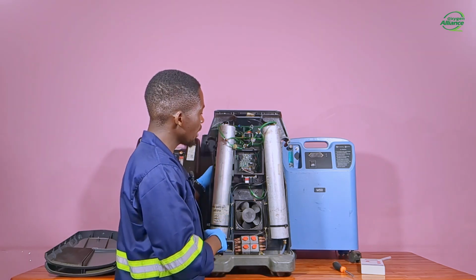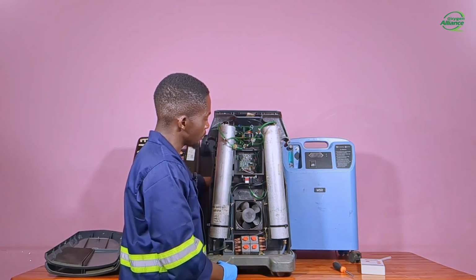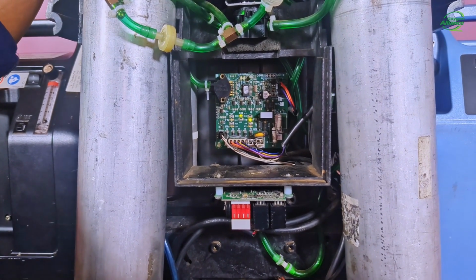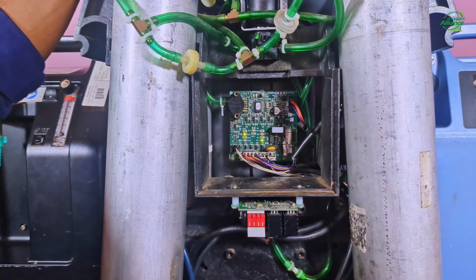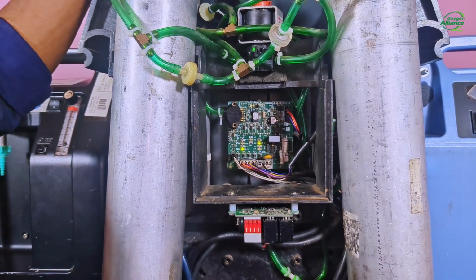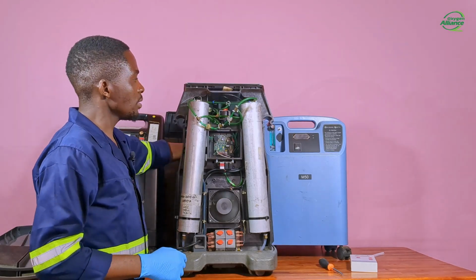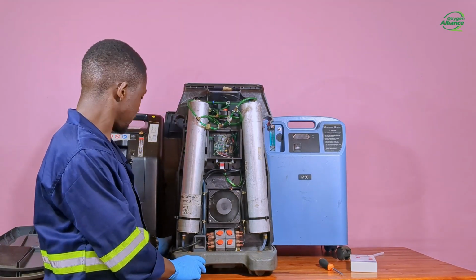Now I'll turn it on and see if all the LEDs are working properly. As you can see, all the 5 LEDs are working properly, meaning to say even the valve is working properly. So I'll go ahead and check the oxygen purity. I'll turn off the machine, replace the covers, and then measure the oxygen purity.